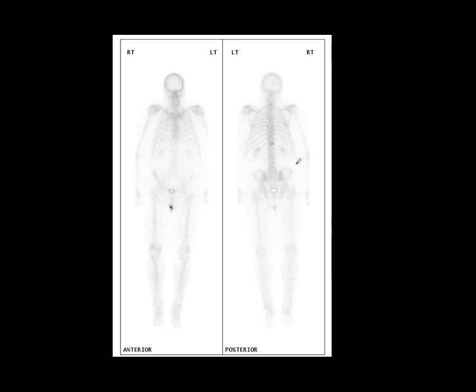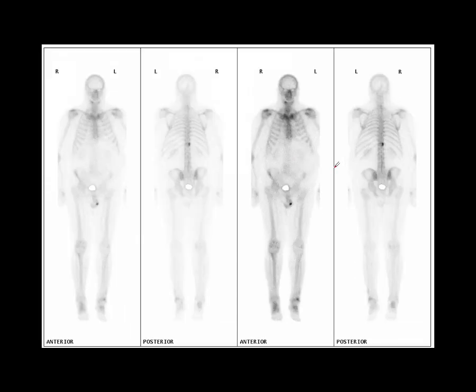What happens is, as I mentioned in my previous talk, all bone metastases are lytic. The reason why they show as being lytic or sclerotic on a CT scan, or taking up tracer or not taking up tracer on a bone scintigram, is due to the relative activity of the underlying lysis and reparative osteoblastic processes. So that's why osteoblastic metastases show up so well on bone scintigrams.